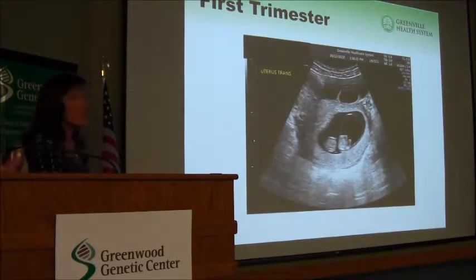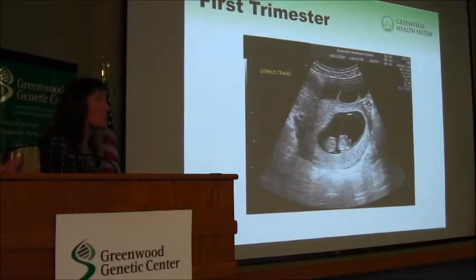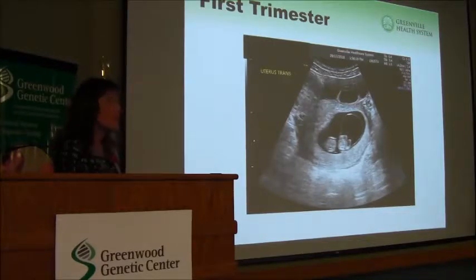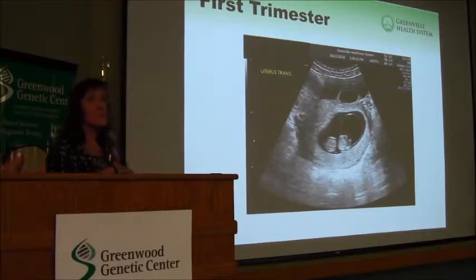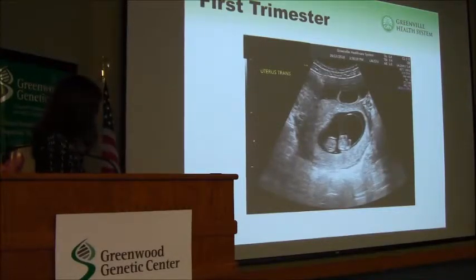And then I put this in here just to remind you, the other thing we can see in the first trimester is how many babies. So are there 2, are there 3, are there 4? And we can look at not only the number of babies, but we can look at the amnions, we can look at the yolk sacs and see whether they share placentas, what type of twinning they are, and those are very important as we look long-term at vascular supplies that may affect the fetal birth defects.